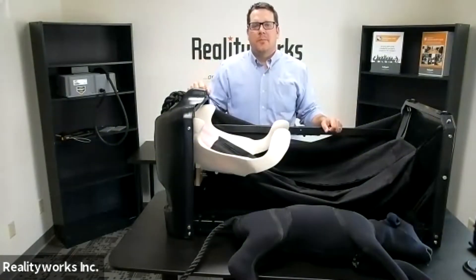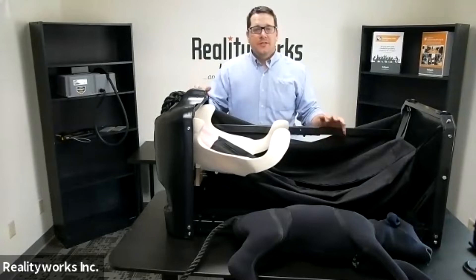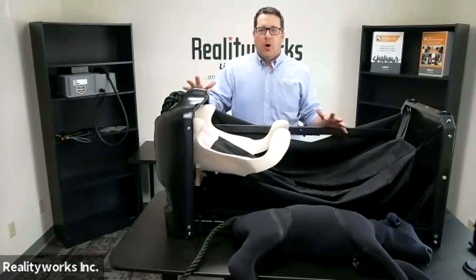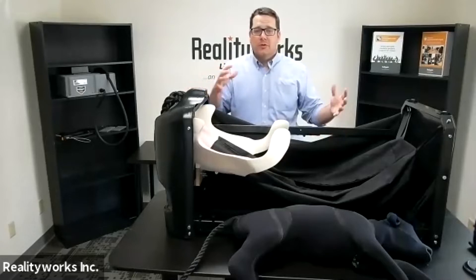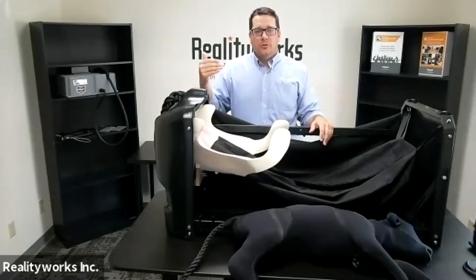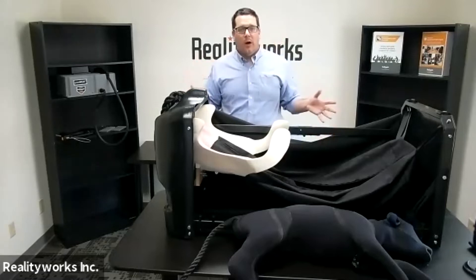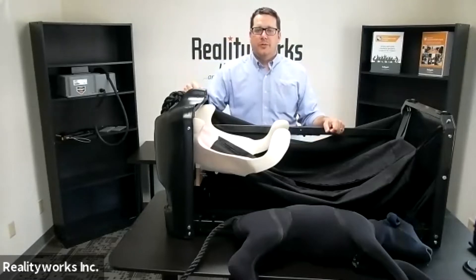I want to introduce you to our bovine birthing and ultrasound simulator by RealityWorks. This is an exciting product that walks you through hands-on learning to be able to do the birthing process of a calf and ultrasound the different stages of that birthing process. I want to walk through this product and give an overall understanding of the vision of the product.